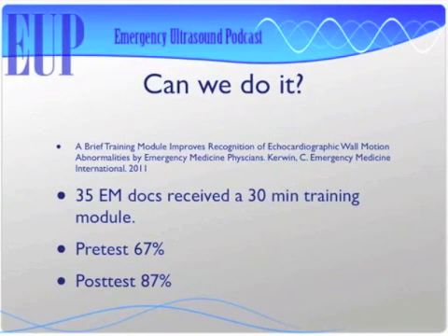Yeah, no, this just goes along with what we always say: ultrasound is cheating. Somebody comes in with chest pain, we have no idea what they have. We have a pretty low roll-in rate nowadays in the emergency department, but you can actually take a look in and cheat. Yeah. It makes your job a lot easier. It potentially could. So should we try to make it a little bit easier? Teach me how. Let's do it.